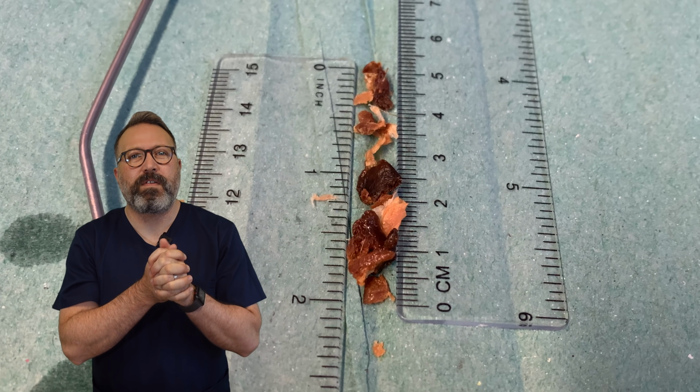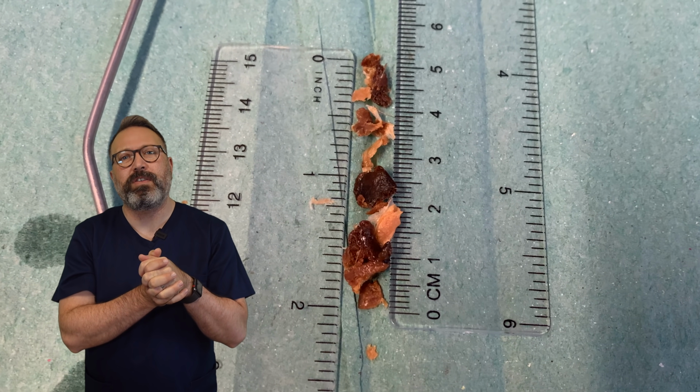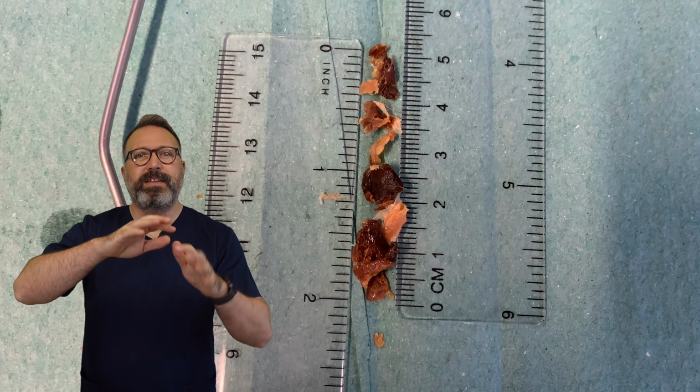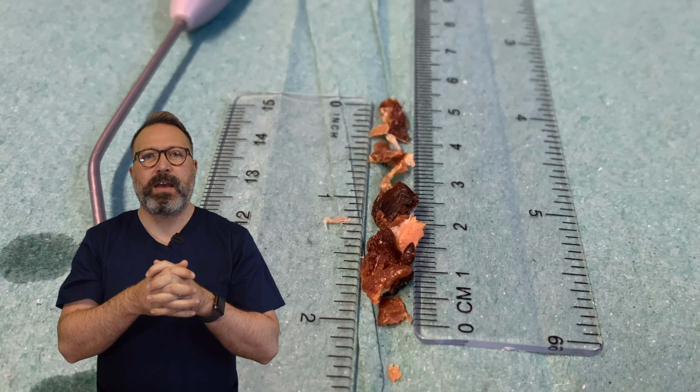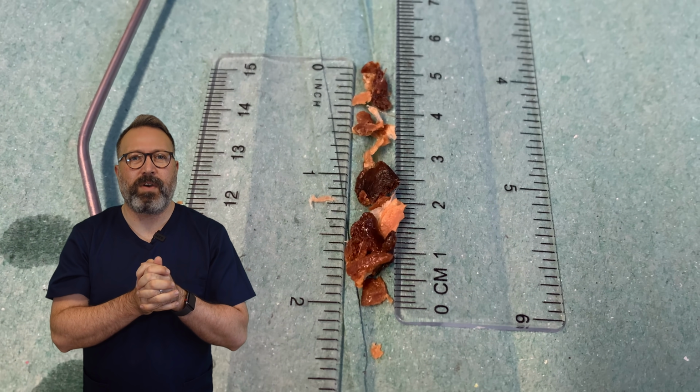So this is what we removed. We got 5 centimeters, 2 inches worth of wax. You can see all these various plates and various colors in here. Some has got skin mixed into it. Some has the chunks of wax in there as well.